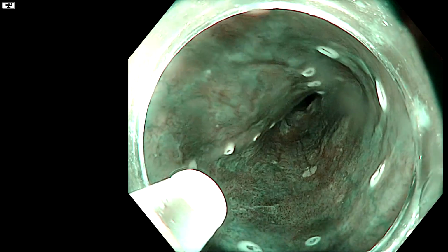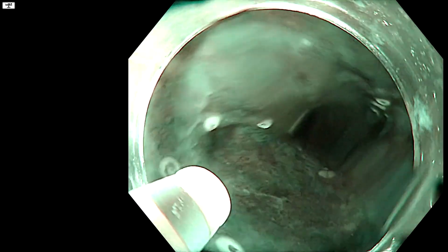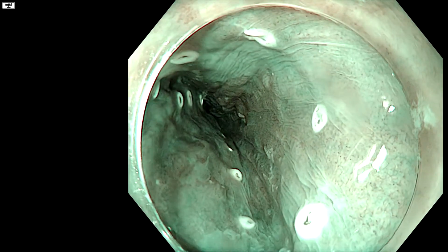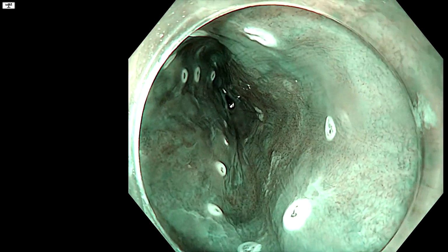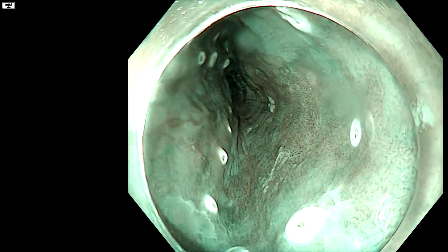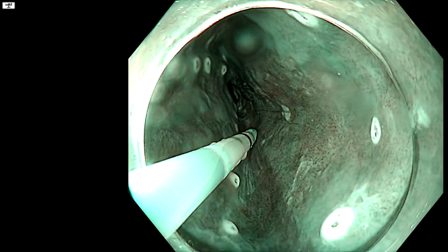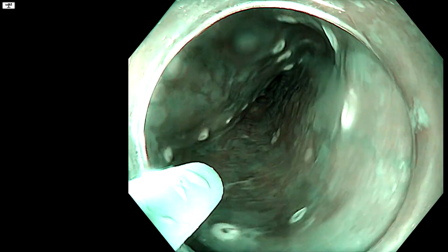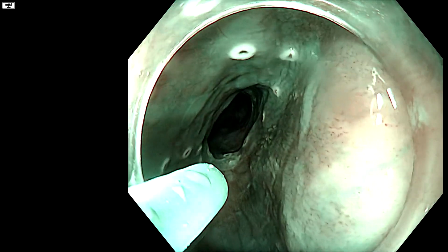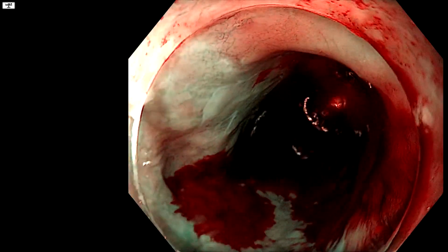Okay, so I think we have the majority of that thing in here. This edge is a little bit suspect. So now we'll go for the Lugol's iodine to decide whether or not that's sufficient. I mean, I think you have to consider in this patient already had radiotherapy to be, we've only found dysplasia, we've not found cancer. We don't see huge evidence of highly abnormal IPCLs to be a little bit conservative in terms of stricturing. Okay, we can go. Stop. Patient's intubated as well.